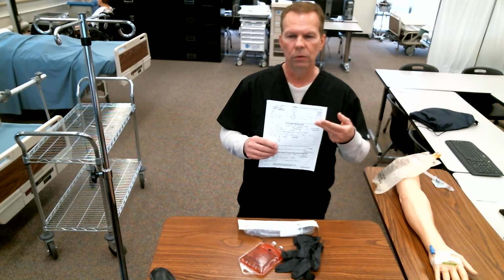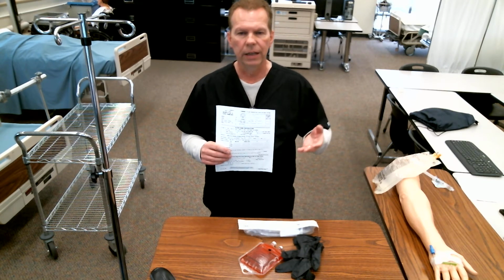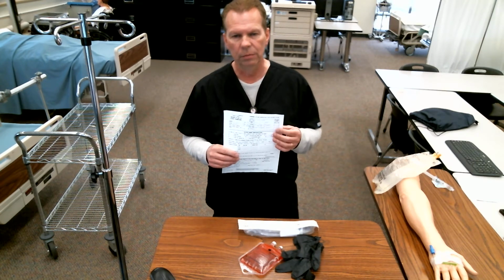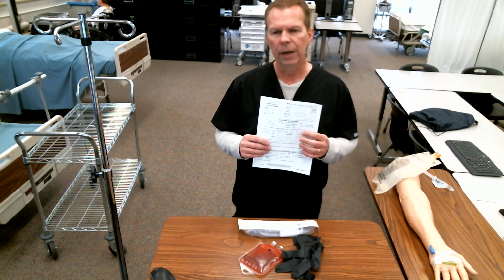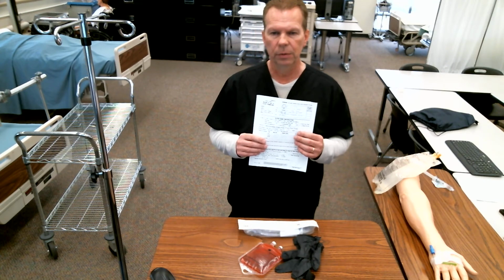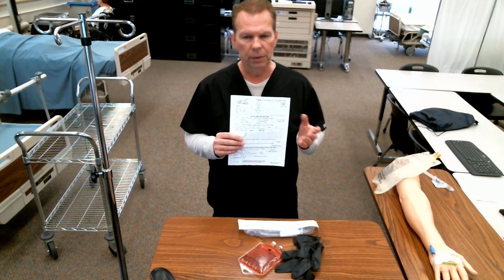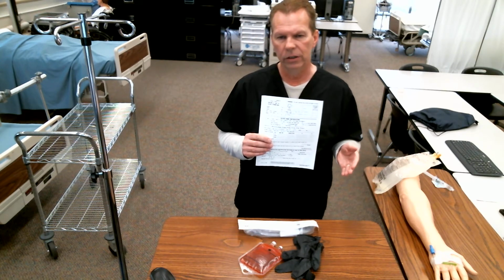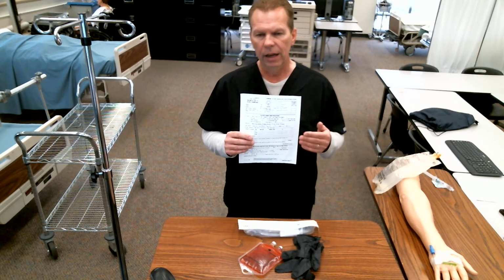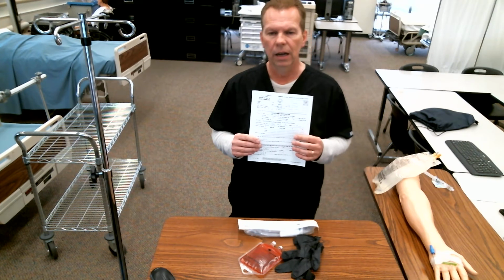I want to make sure that I've got the right patient name, their room number, hospital ID number, the doctor's name, the diagnosis. Does it make sense that I'm getting ready to give this patient blood? We want to make sure of expiration date when we get the blood, that we look and make sure the expiration date is good. We want to make sure that we look at the recipient's RH factor and the donor's RH factor, the recipient's blood type and the donor's blood type. So we want to make sure that those are compatible, that we can give that.